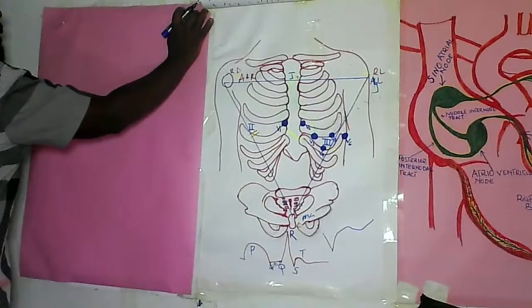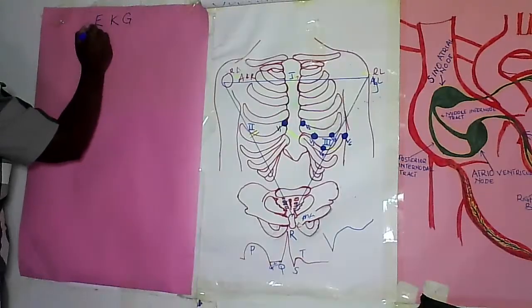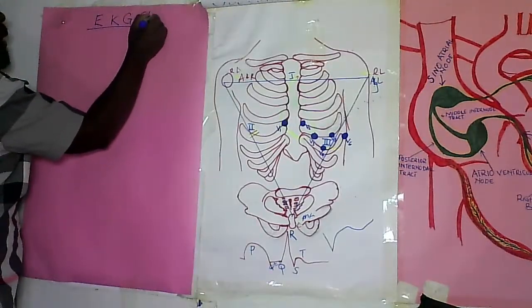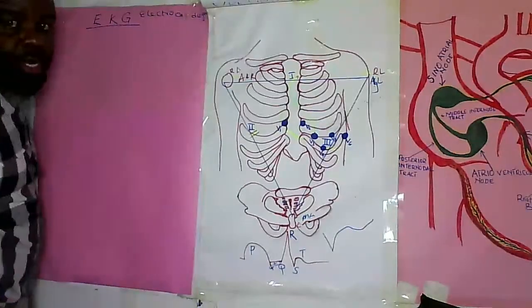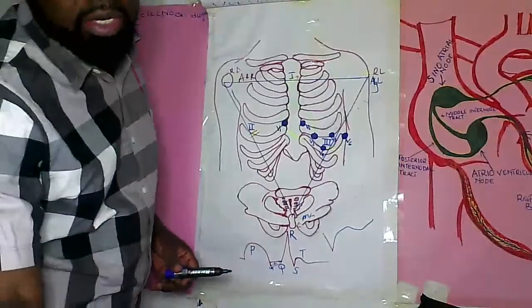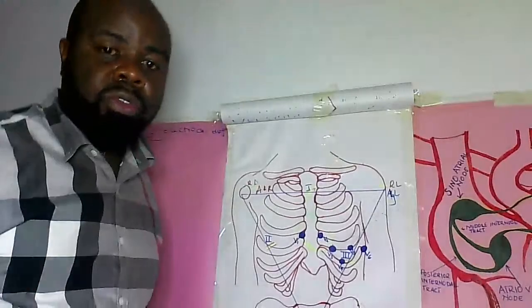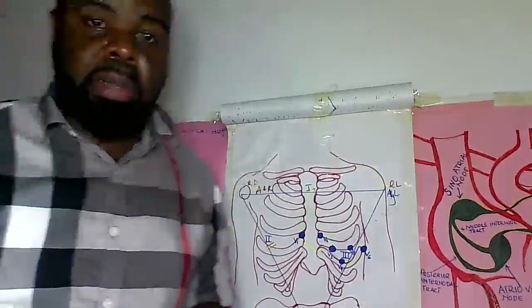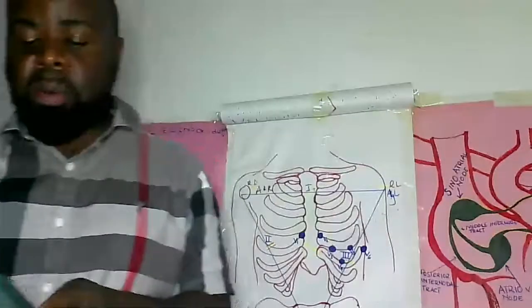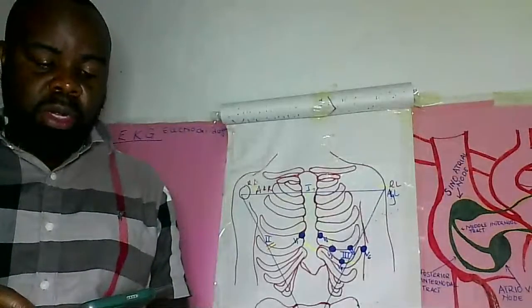There are several steps for the EKGs that we have to learn. One is the electrocardiogram. Electrocardiogram, you said it's used to diagnose heart conditions and several things that the heart undergoes when it comes to impulses, and some issues when it comes to heart blocks.